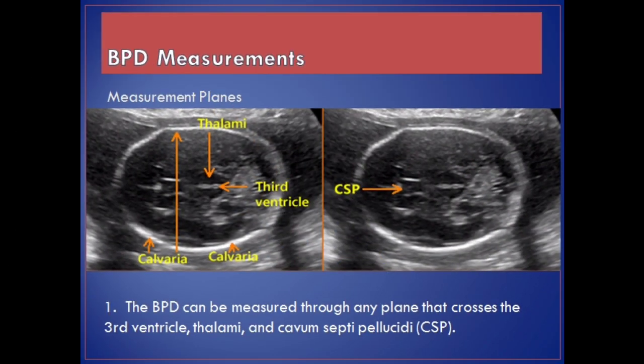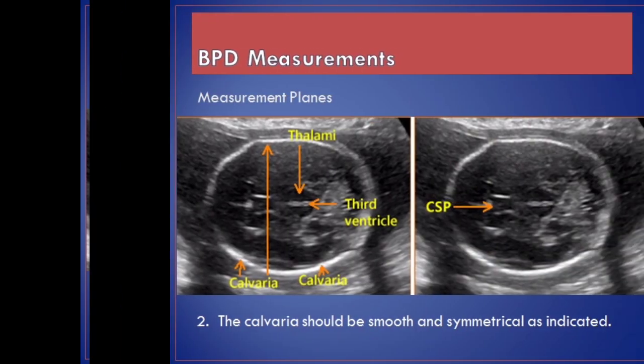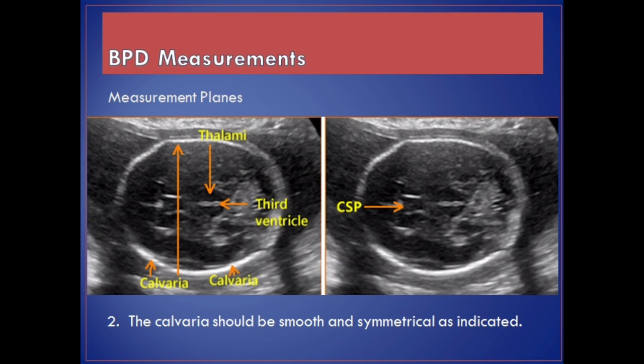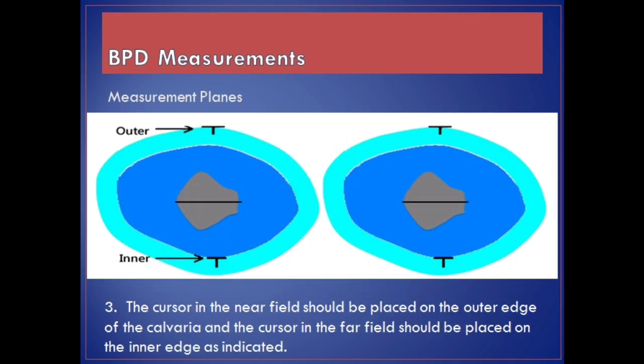BPD measurements — measurement planes. The BPD can be measured through any plane that crosses the third ventricle, thalami, and cavum septi pellucidi, CSP. The calvaria should be smooth and symmetrical as indicated. The cursor in the near field should be placed on the outer edge of the calvaria and the cursor in the far field should be placed on the inner edge as indicated.